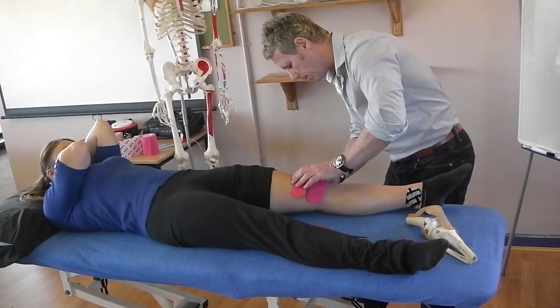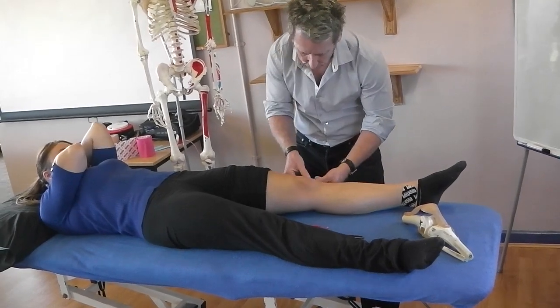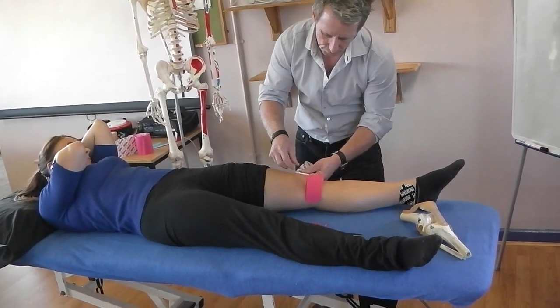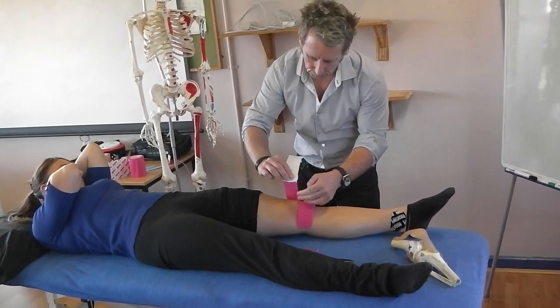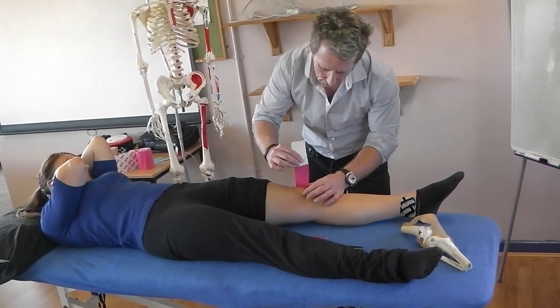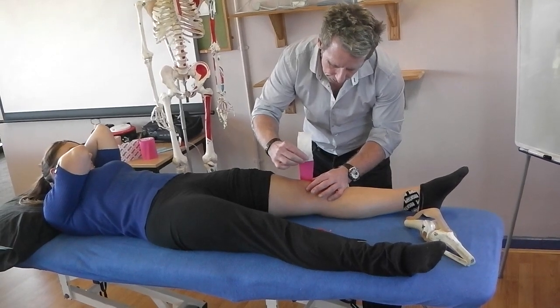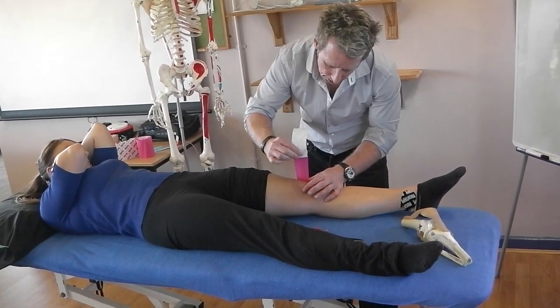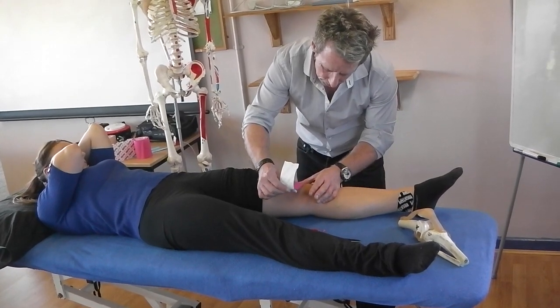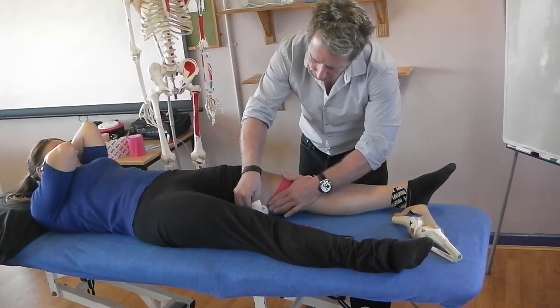No stretch at the beginning of the tape. Then I'm going to split this tape so that each leg is separate, and peel that back. Using my patella thumb, push the patella medially. I'm going to increase the tension of the tape to about 50 to 75 percent whilst I'm pushing with the patella, then come across and bring the tape slightly lateral and stick that down.